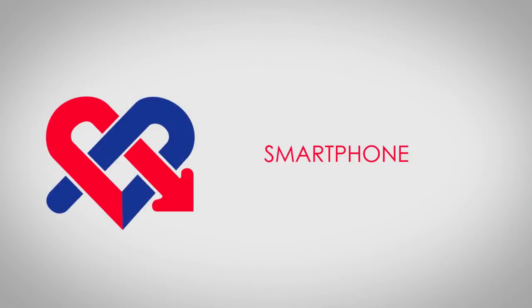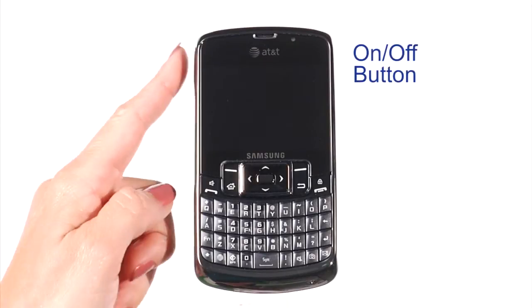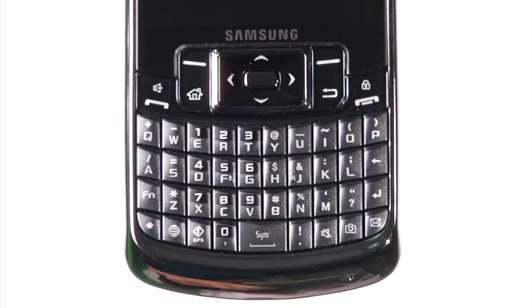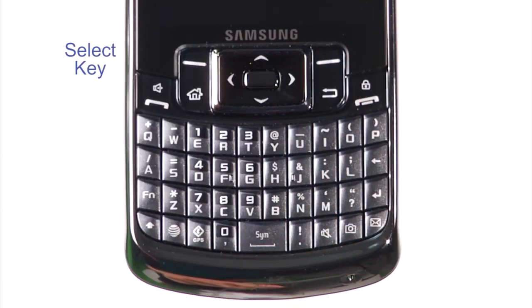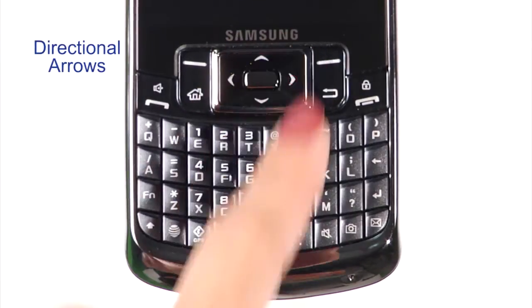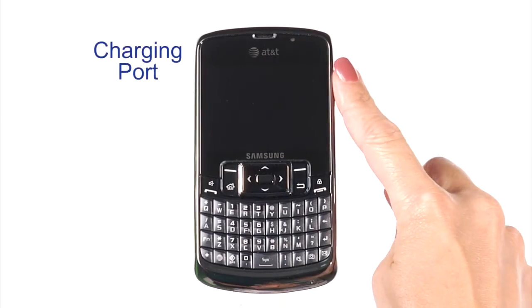Let's first become familiar with the MediComp Smartphone. There are a few buttons you will use throughout your procedure: the on/off button, left soft key, right soft key, select key, directional arrows, and back key. You'll also be using the charging port. The smartphone has been configured for the cardiac monitoring functions only and cannot be used as a phone.